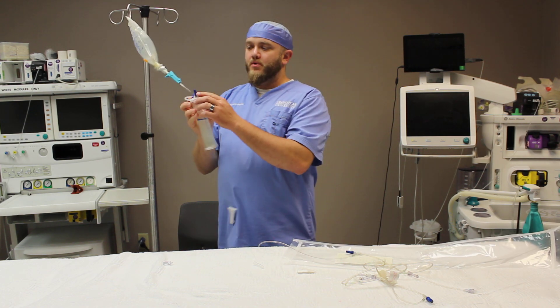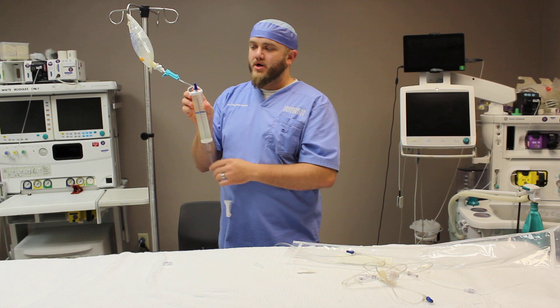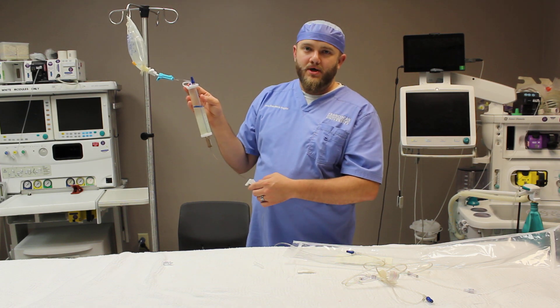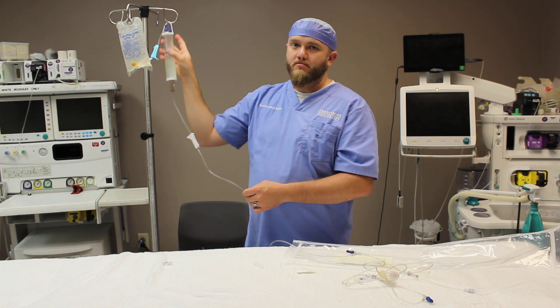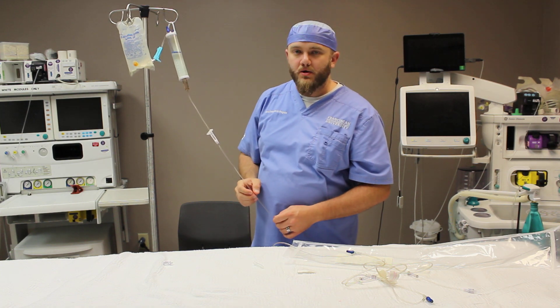There's also a port up here on the top of the buret chamber. That's where you can inject medicine into the buret chamber to give it over a longer infusion time, rather than just giving the patient a bolus.